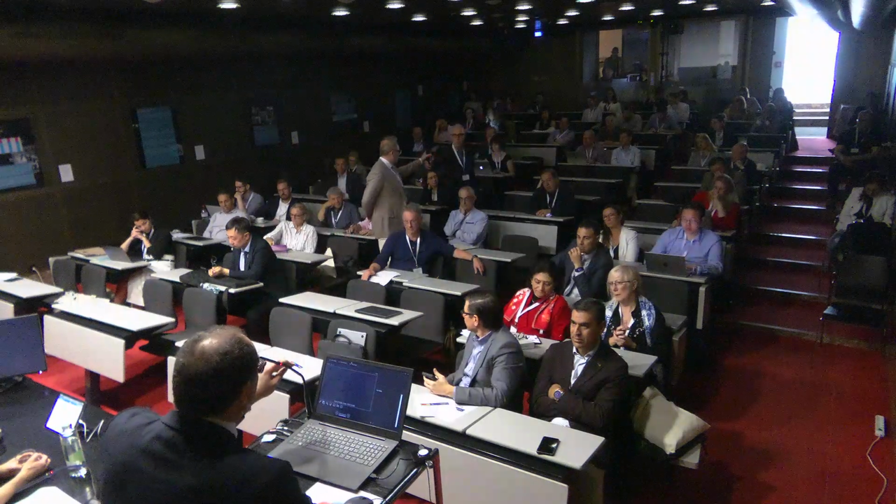Yes, thanks Giuseppe for your question. There are some studies published already. For brevity, I didn't include them in this presentation; I will talk about it in the afternoon. Yes, elastography is able to assess and check fibrosis, and this is very important even after repair of OASIS. So we do an overlapping repair, we do an end-to-end approximation, and after some time, we want to see if the fibrosis is okay, if the muscle is working, and elastography can help.